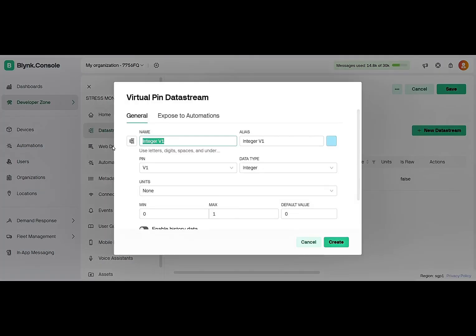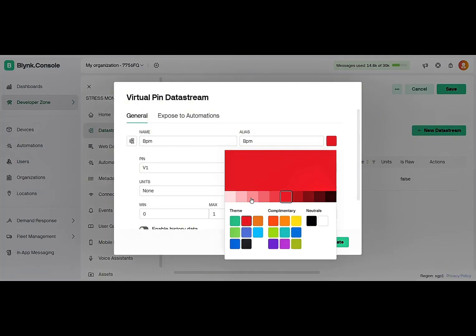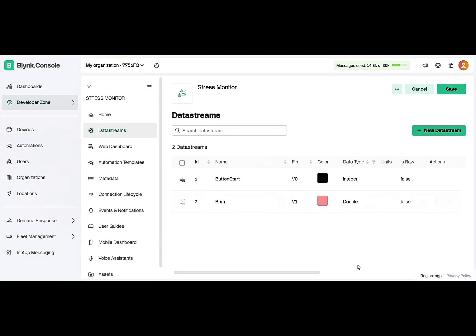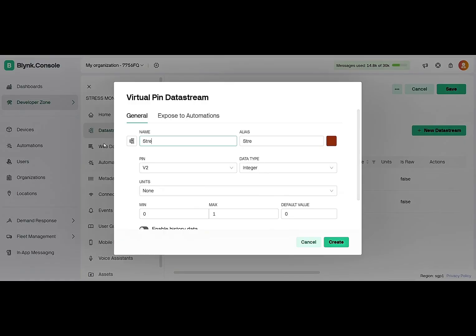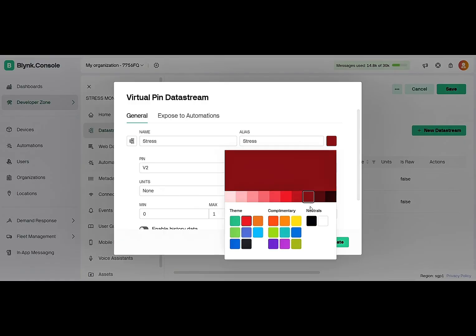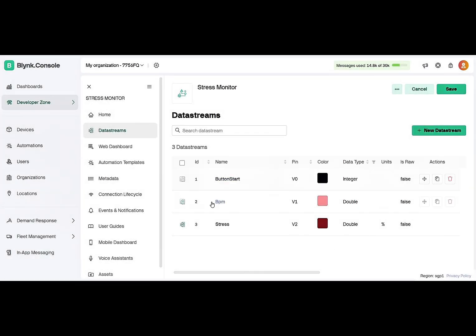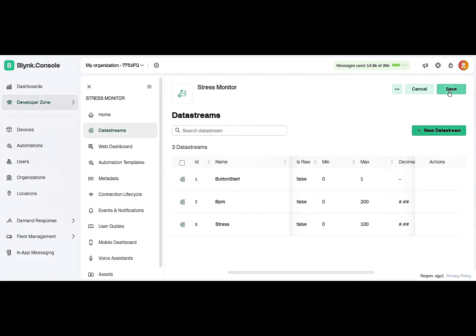Next, we will add the BPM for showing the data in Blynk. We will use the double data type and the max is 200. Next is the stress. We will use double with max 100 because we will use the percentage. Don't forget to save.